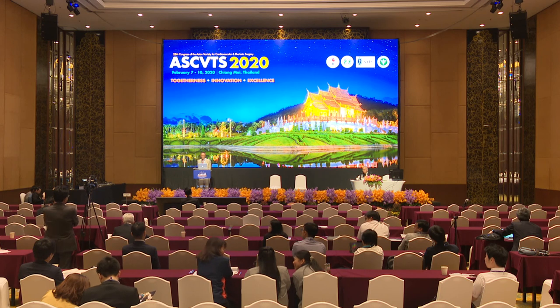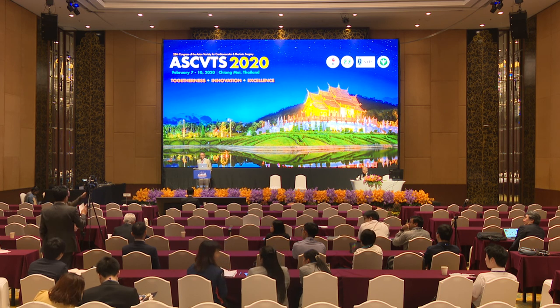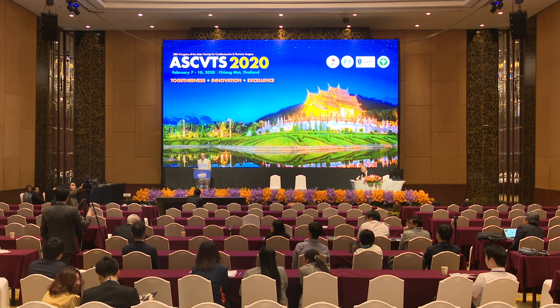Well, in Japan, harvesting the IMA, ITA, is mainly a job for the young surgeon. And in Japan, we have done a nationwide survey for the young surgeons, on how they are trained and how they have trouble in ITA harvesting. And we found that 90% of the residents experience trouble when harvesting the ITA. The first thing is dissection of the ITA, and the second problem is branch injury with ITA bleeding. So that's two big problems. So how do you teach the young surgeon to avoid or prevent or manage these two big bad things?